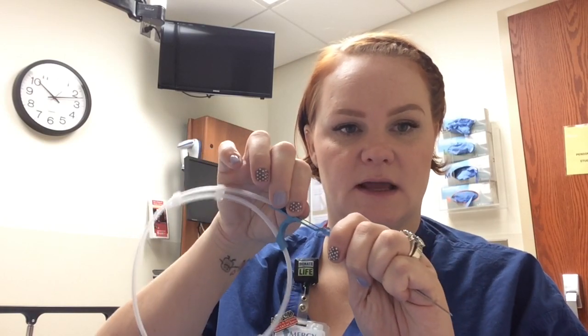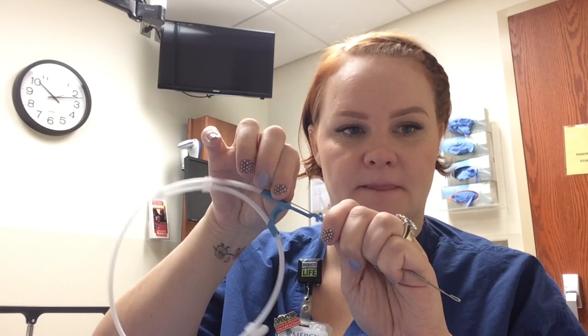The physician will then inject the patient with lidocaine into the location — so if the patient is getting a subclavian, they'll inject it right here. Once the area is numbed with lidocaine, the physician will go ahead and insert the large needle with the blue plunger into the site. Once the physician is comfortable with the location and is into the vein, he will insert the wire guide into the needle, advancing the wire until comfortable with the location. A key concept to focus on: once the wire is guided into the superior vena cava, keep an eye on the monitor. The patient will typically have some irritability with the heart and have PVCs or runs of PVCs — it's important to tell the physician about that, as it helps confirm good wire location.